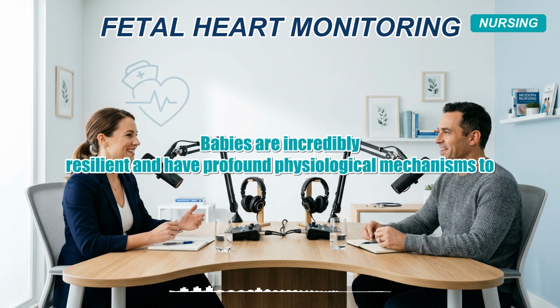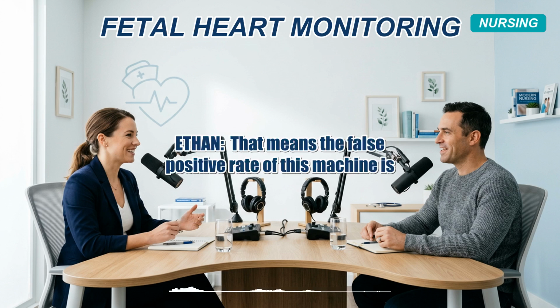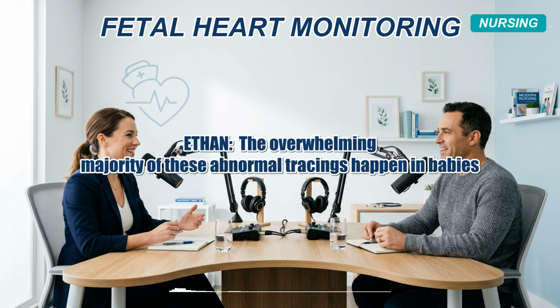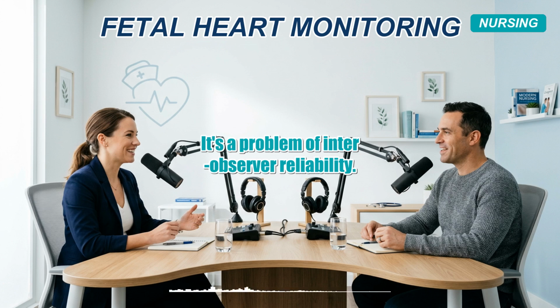Babies are incredibly resilient and have profound physiological mechanisms to survive temporary oxygen deprivation during birth. That means the false positive rate of this machine is sky high. Yes, exactly. The overwhelming majority of these abnormal tracings happen in babies who turn out to be perfectly neurologically normal. And that leads to the other major failure point, human error and the limits of interpretation. It's a problem of inter-observer reliability.